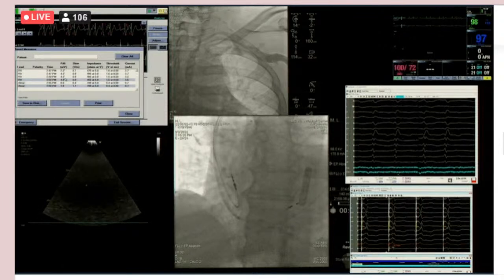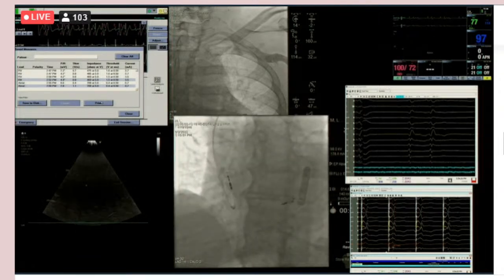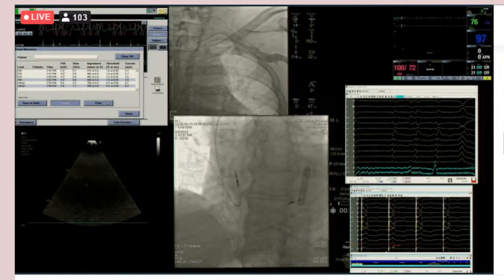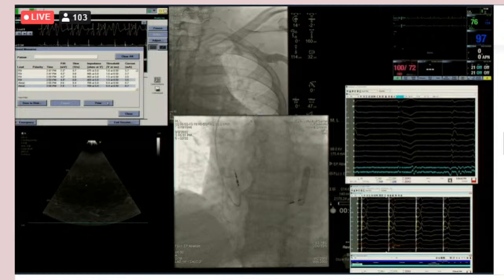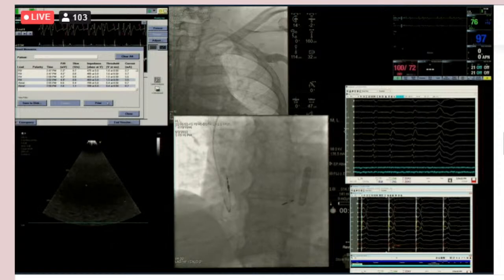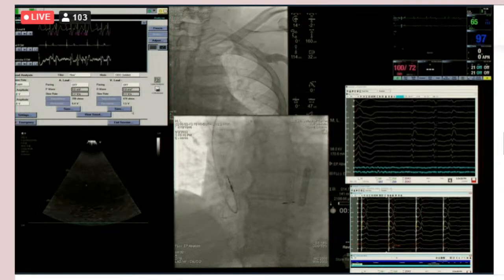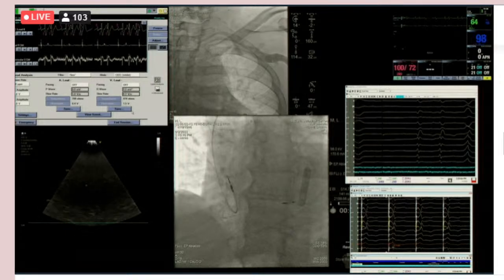Yeah. Well, I think the other point is, how many times have you seen 90-some-year-old people with disasters when the lead goes into the apex and just goes right through? So doing this, even if you didn't care about capture of the His-Purkinje system at all, avoiding sticking leads in the RV apex is really an advantage. And if you do this in everyone, and it's not critical that you capture the His-Purkinje, you can take the one that's difficult and just say, forget it, I'll take the septum because this one wasn't critical. Then when you get better at it and you really need to capture the His-Purkinje, you know what you're doing. So I'm fully in agreement with that, particularly for these older people. We just see too many of these people come back.